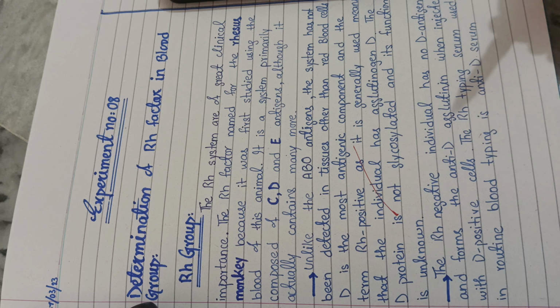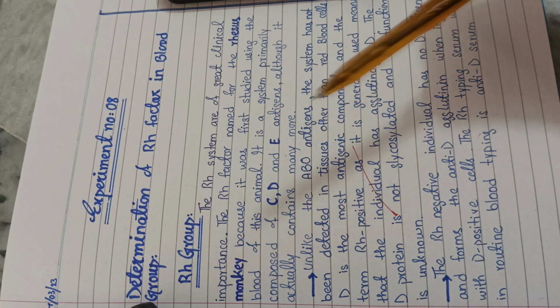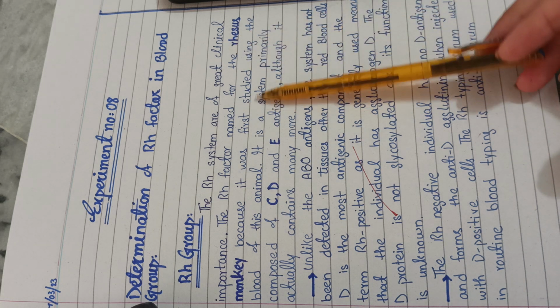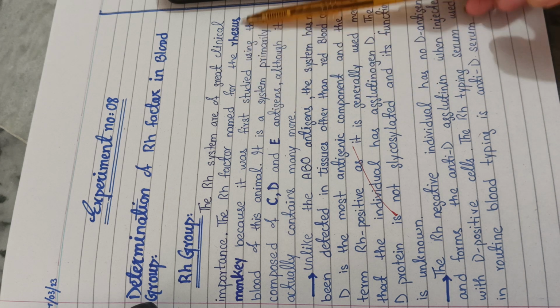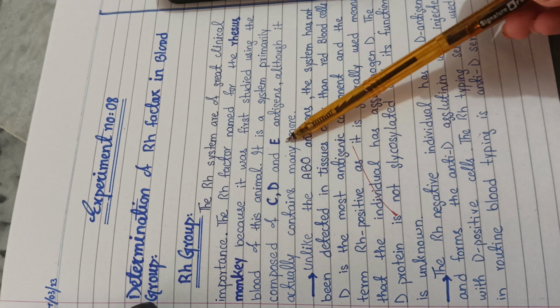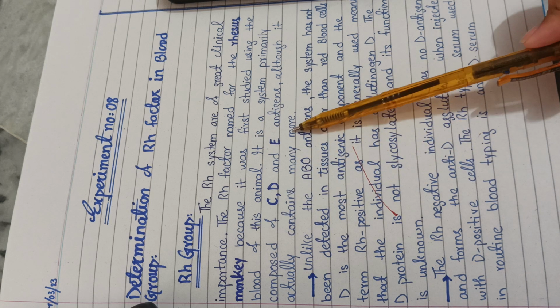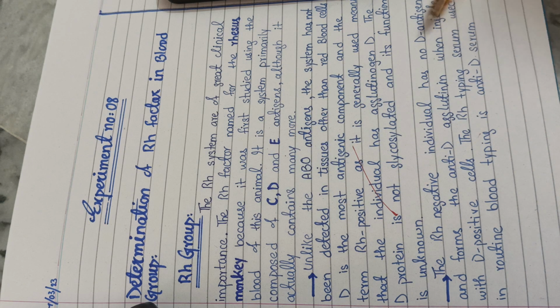This is experiment number 8, and now you are going to detect the Rh factor. The Rh system is very important, and it takes its name from the rhesus monkey because it was first discovered in a rhesus monkey. So therefore it is given this name. It is composed of 3 antigens, C, D and E, but majorly D is responsible for it.